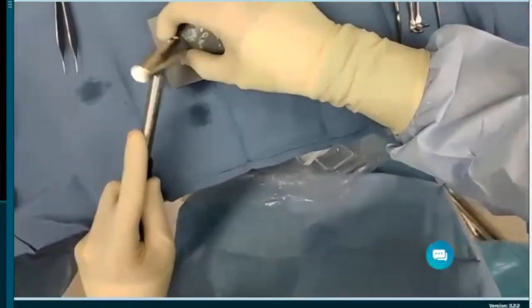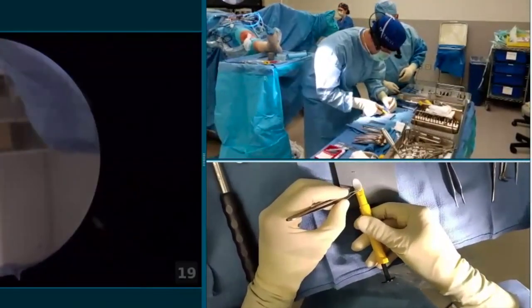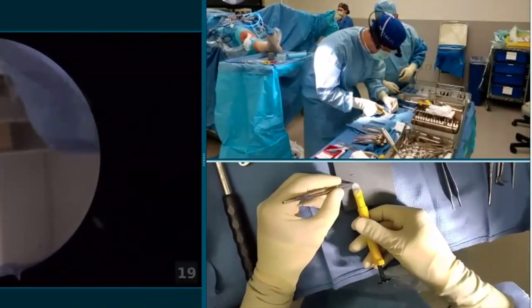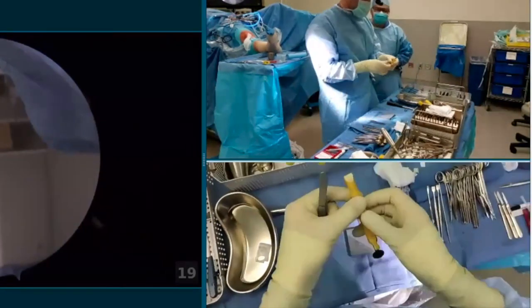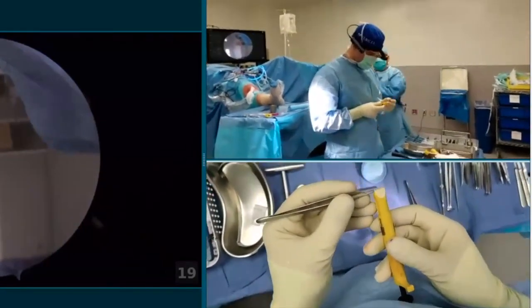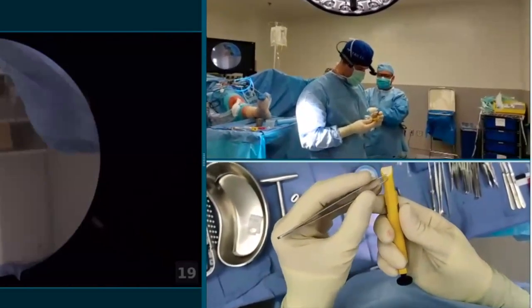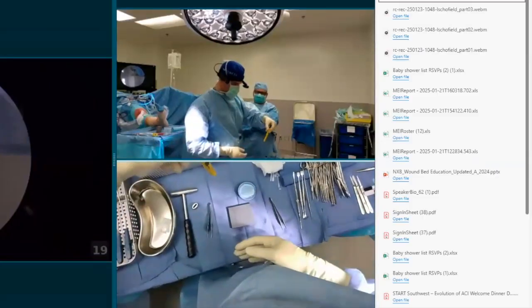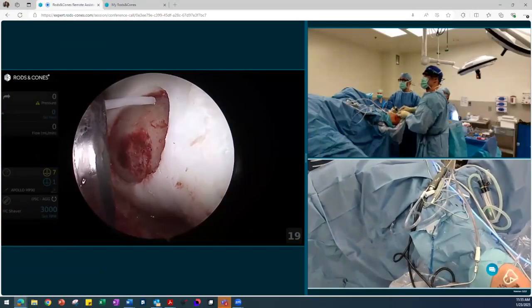Again, cell side is up. We're going to mallet on both sides, and then we'll pull this away and we'll put this in the medium, and then we're going to slide this onto the V shuttle. You can see here you want to make sure that the MACI is on both sides of the fingers so that it can be deployed appropriately. Again, this has a great suction seal. It will not come off until you fire the V shuttle.